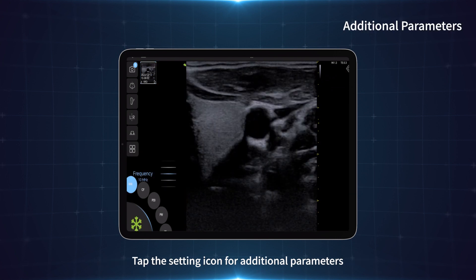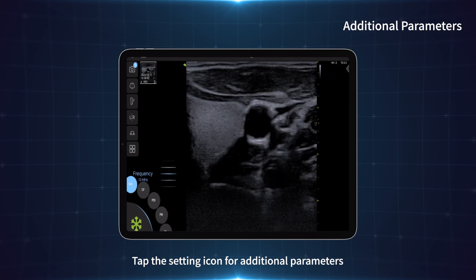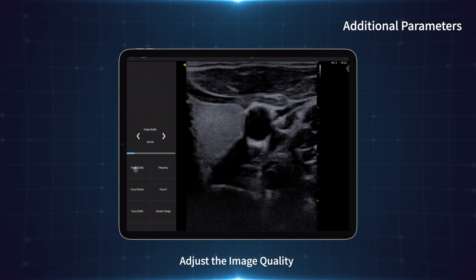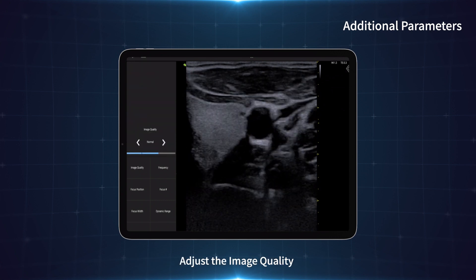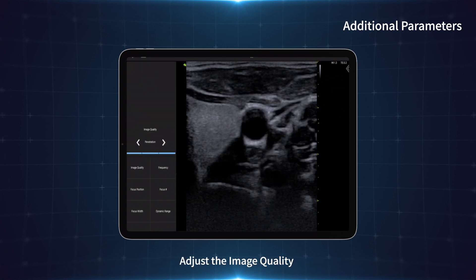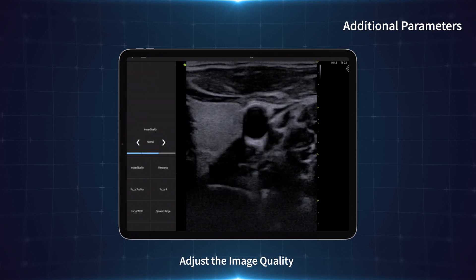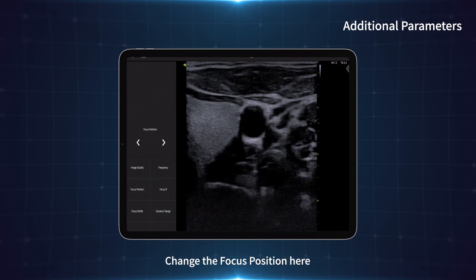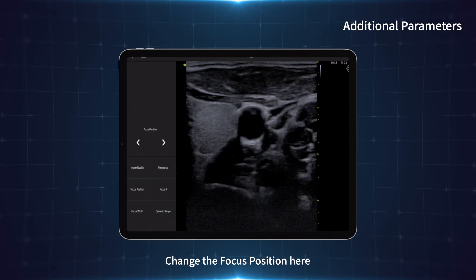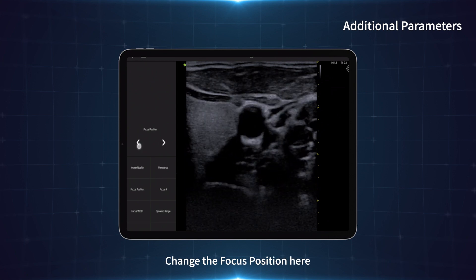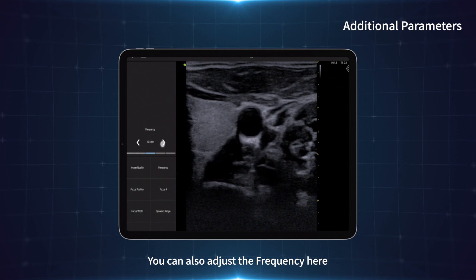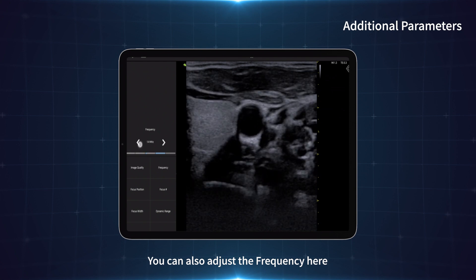Tap the setting icon for additional parameters. Adjust the image quality, change the focus position here, and you can also adjust the frequency here.